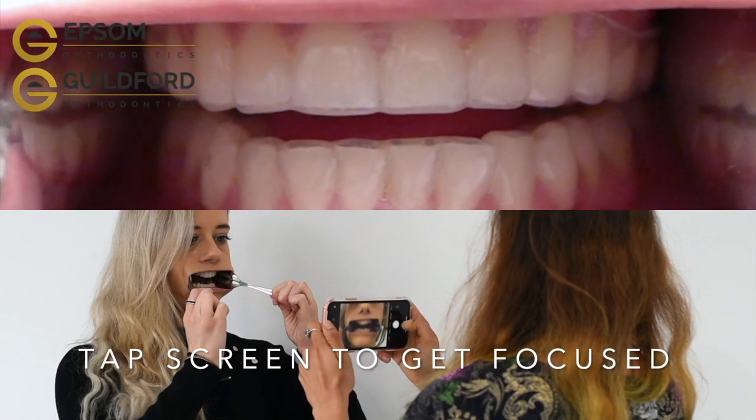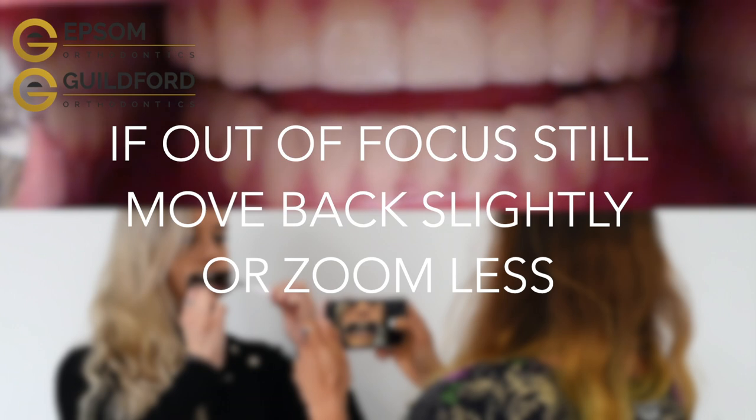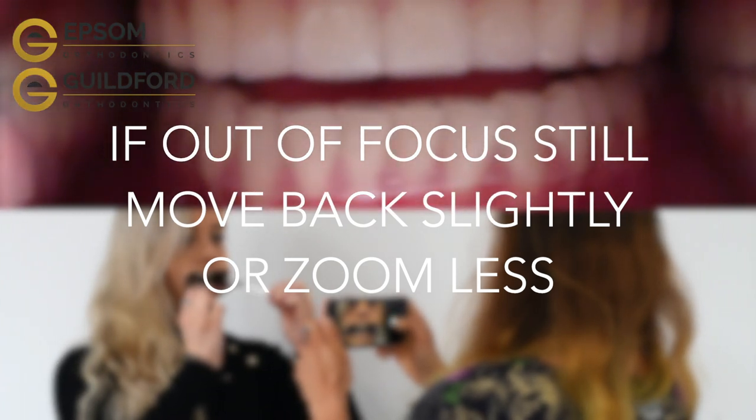Tap the centre of the screen to make sure all is in focus. If you find the picture to be out of focus still, move the camera back or zoom in less.